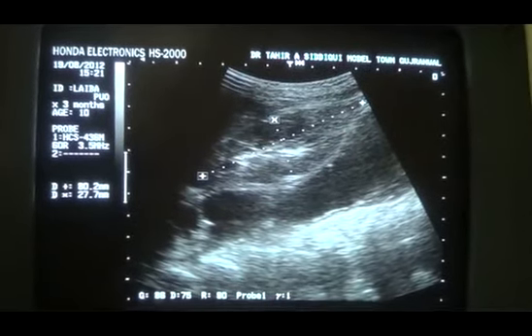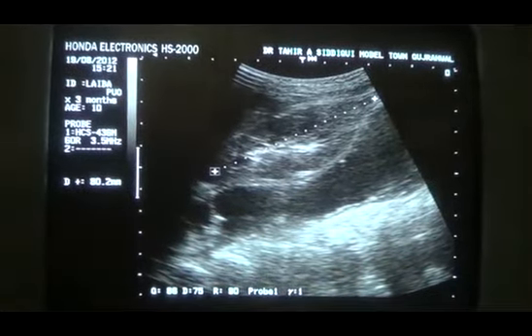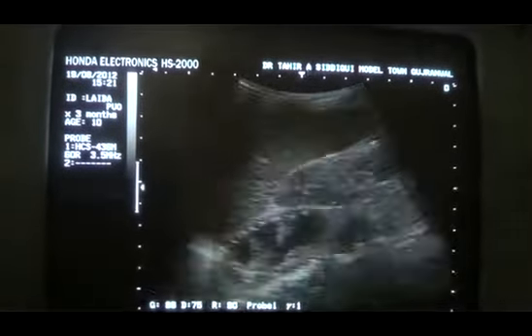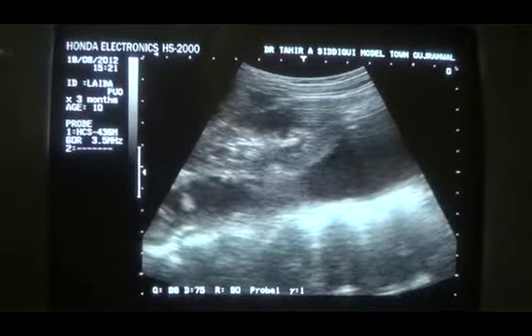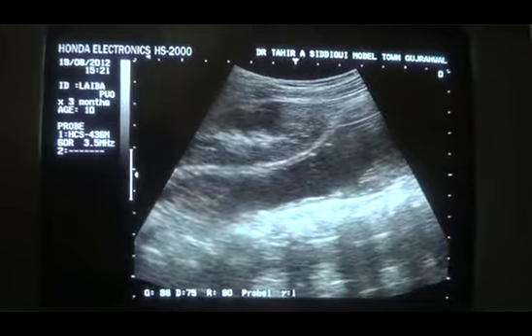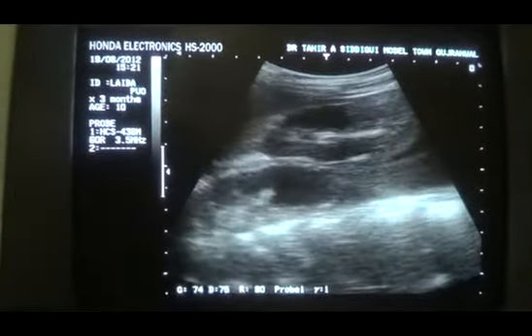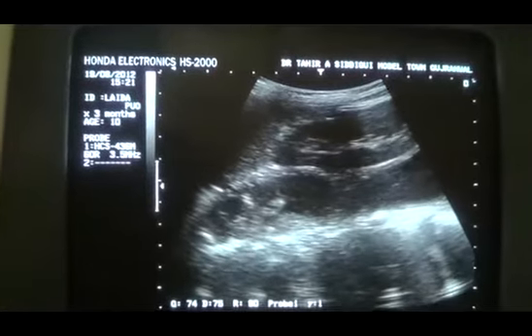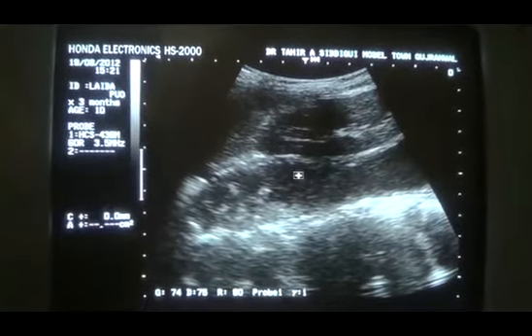As we know, the kidney glides over the psoas major muscle. So where is that muscle? Let's see, where is that muscle? Now, instead of the muscle, we are seeing a tubular structure with marginal echogenicities. This is the left kidney.